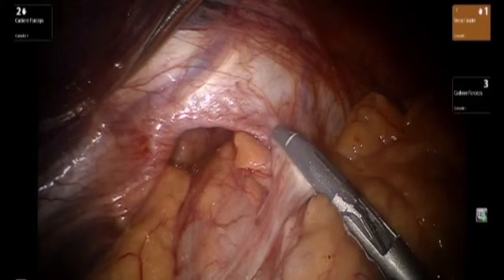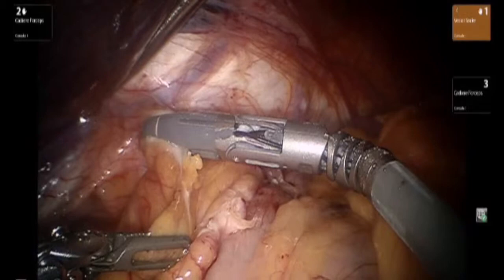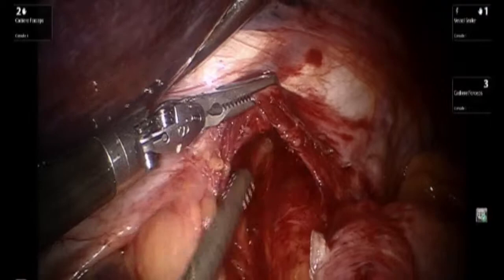We proceed by opening up the hernia sac, starting from the left side and proceeding circumferentially towards the right crus. We can see the attenuated phrenoesophageal ligament. Dissection continues in the posterior mediastinum.